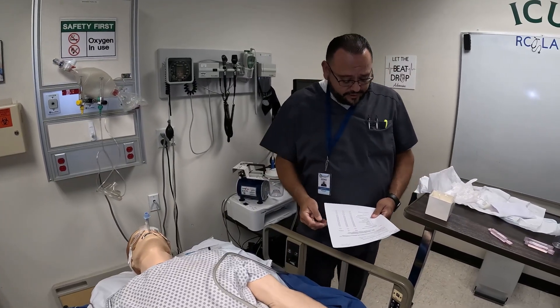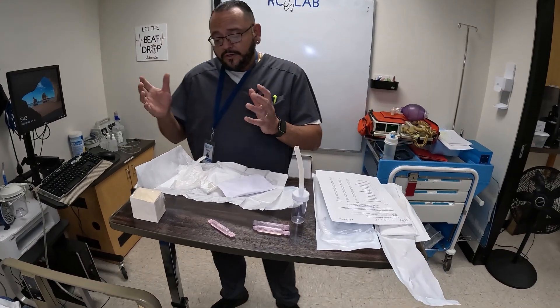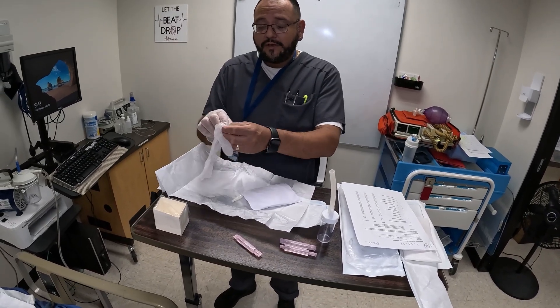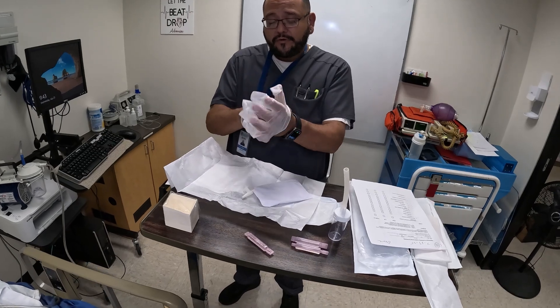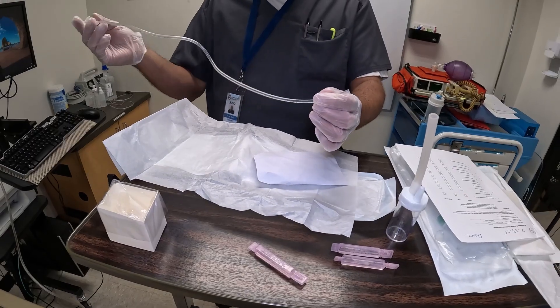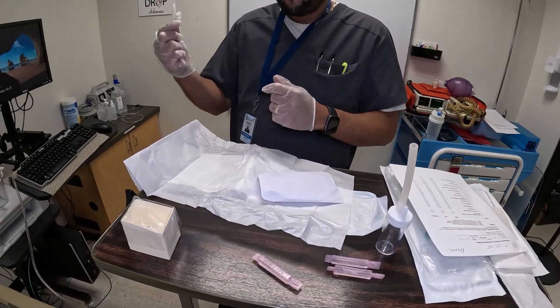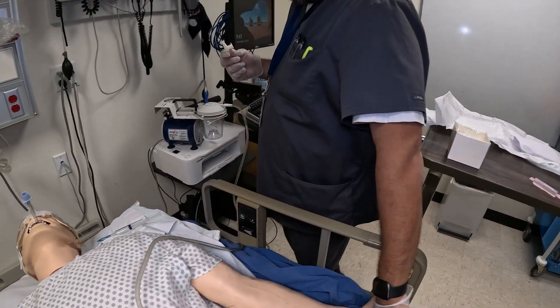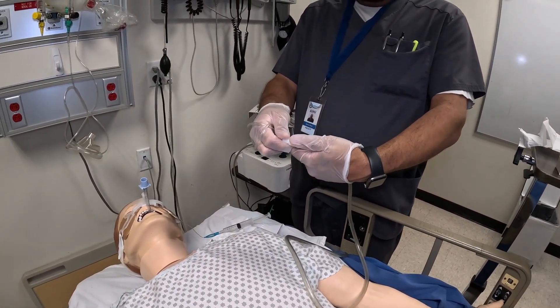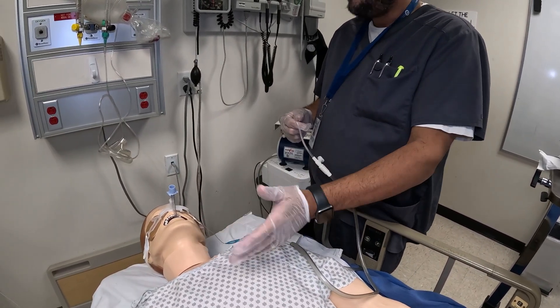For this I'm going to assemble everything and get ready to do the procedure. I'm going to go ahead and put these on — I'm not going to demonstrate the full sterile technique for videotape purposes — but you would grab the glove, keeping one hand as your sterile suction catheter hand. Once I attach the catheter I like to wrap it around my hand so it stays under my control. You attach it to the suction, and you suction by occluding this port here with your finger.